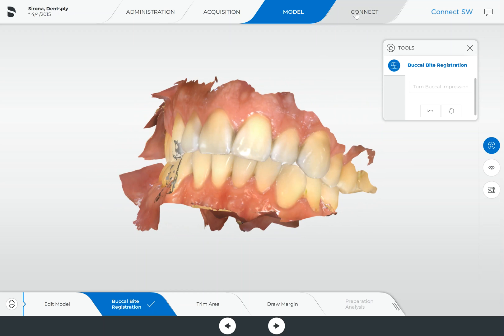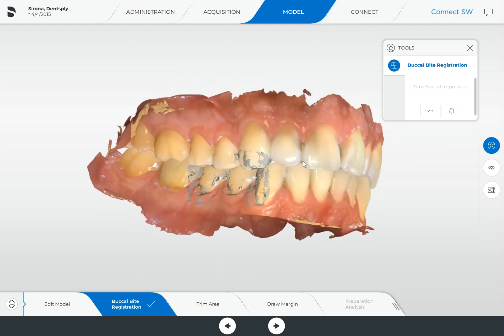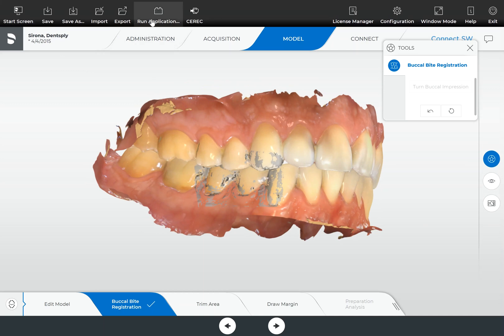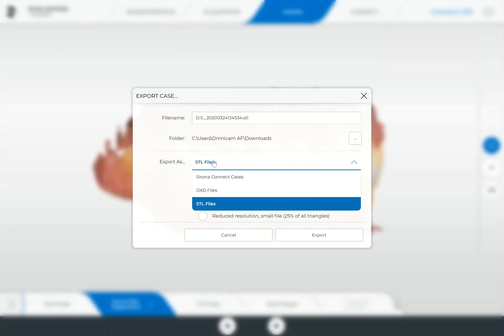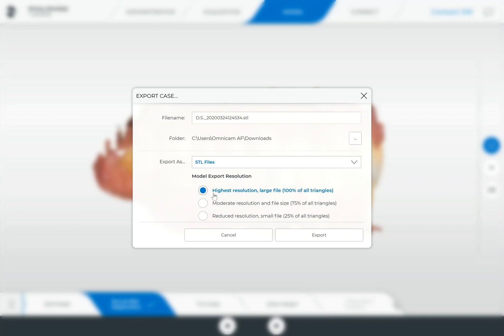You can see up here that the connect button lit up, so we're ready to send this off to a laboratory. Also, if we go up here to export, we now will have some additional file types. We have STL, also DXD if you wanted to take this file over into CEREC software, ortho software, or eventually the oral check software. Or we can export our STL as high resolution for any sort of 3D printing applications.